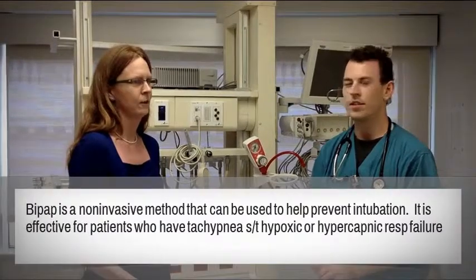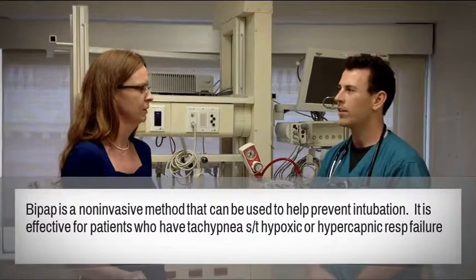So what other modes? Can I use BiPAP to bridge them to intubation or something else? Sometimes BiPAP is able to help ward off someone being intubated. It helps decrease the work of breathing, helps them ventilate better, as well as improve oxygenation. But sometimes it's not enough and intubation is necessary.